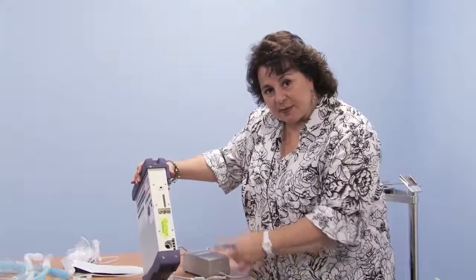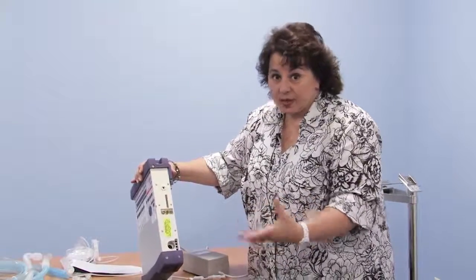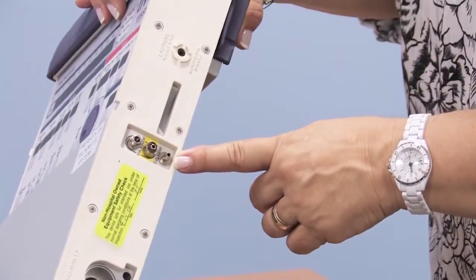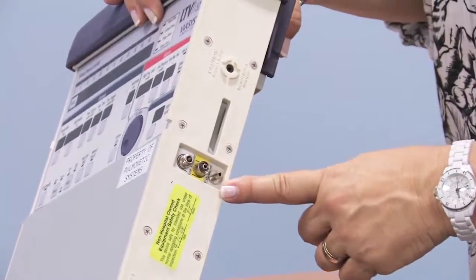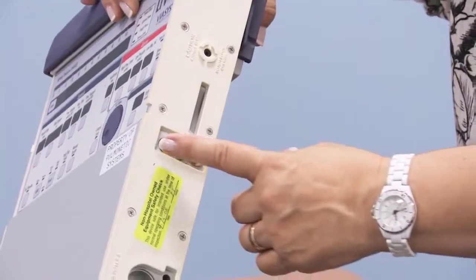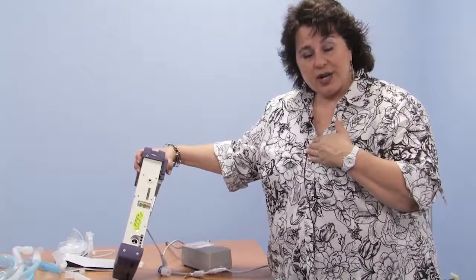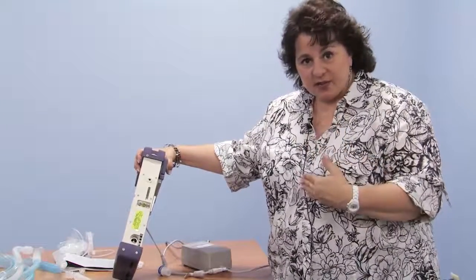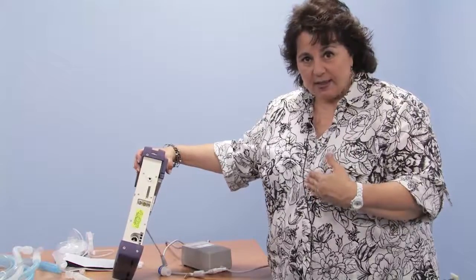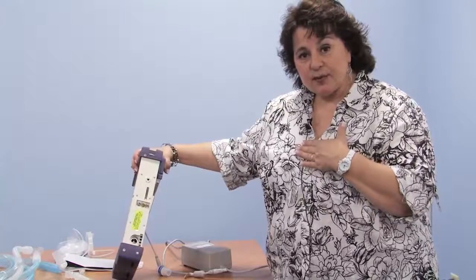On this right side of the machine, we have the gas outlet. This is where the main tubing goes to your child to deliver the breath. We have the exhalation valve adapter here, which will have a small hose on it that goes to the exhale valve, where your child exhales out of the ventilator hoses. And we have these two adapters, which I'll show you in a moment how they connect to the circuitry. They give the machine live feedback from near your child's tracheostomy tube as to how fast they're breathing, the size of their breath, how much air they breathe in a minute, and the pressures that they're receiving into their lungs from the ventilator.